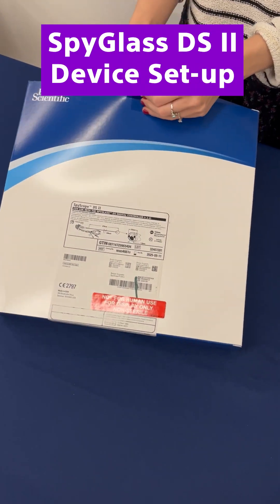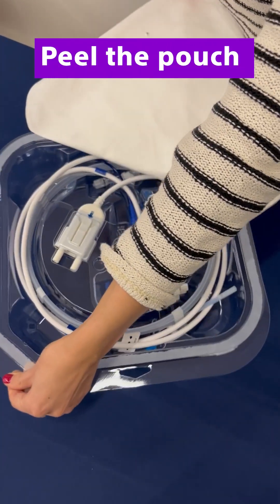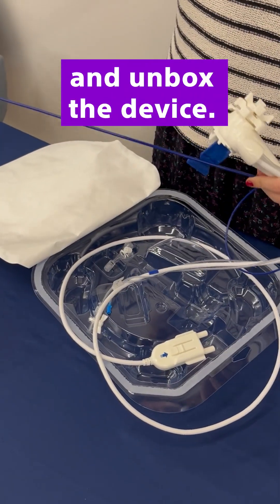How to set up the SpyGlass DS2 device. Peel the pouch and unbox the device.